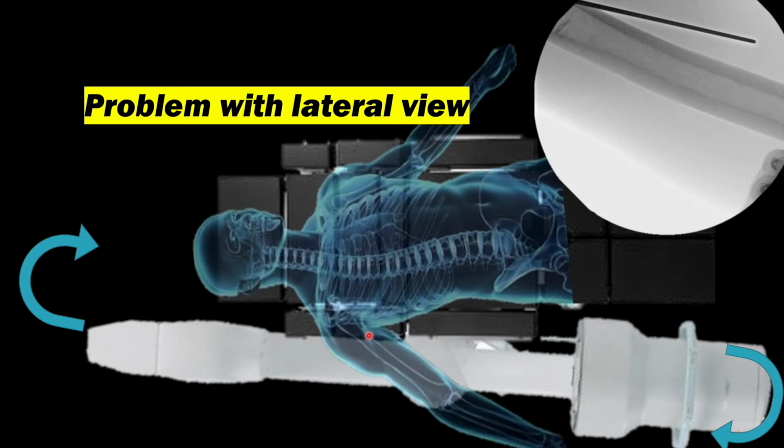So to get the proper axial view, to keep this part of the proximal humerus in the direction of the fluoroscopy beam, we want to tilt this console in this direction. That means this part should come somewhere outside here, while this part should go somewhere here. Then the fluoroscopy beam is going to pass through the shoulder. So the problem occurs when the operating part of the C-arm is in this area. That means the technician is standing here.